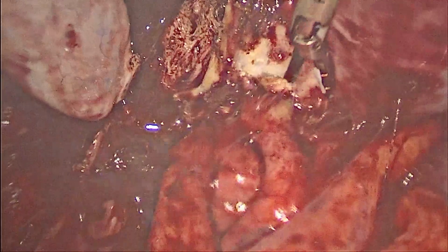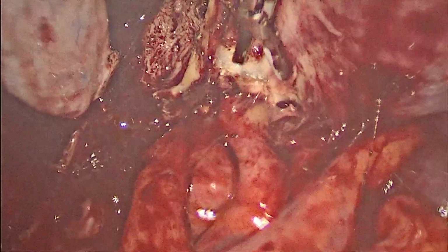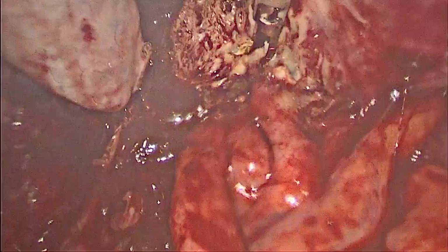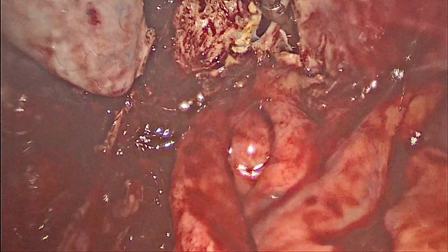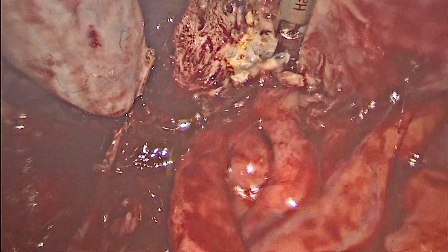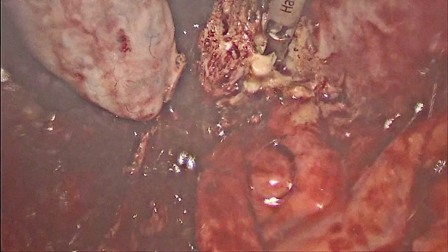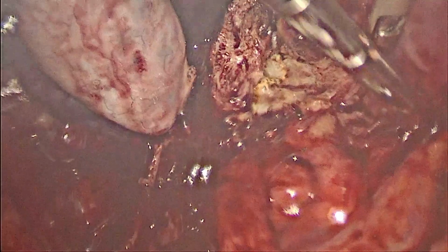In inflamed patients, a small amount of injury will lead to more damage to the intestines. So we should be very careful and keep well away from the intestines and the bladder. Whenever we go close to the intestines, we use the harmonic scalpel. So that's what we are doing here.